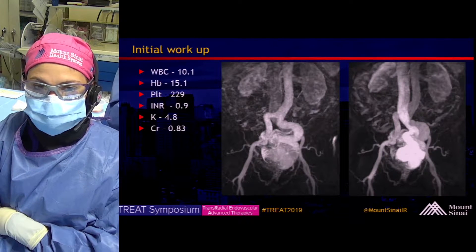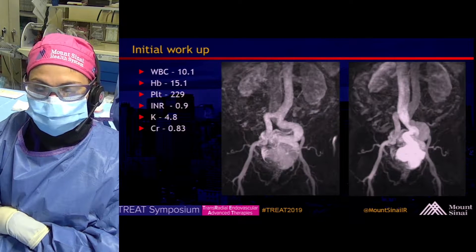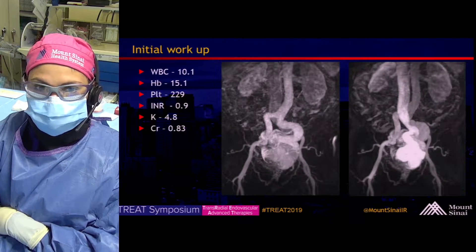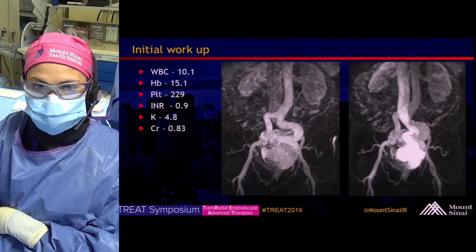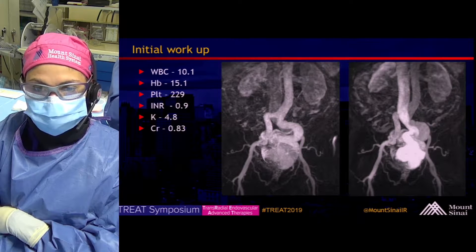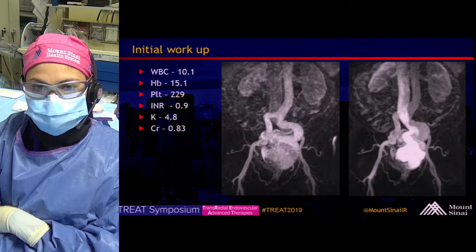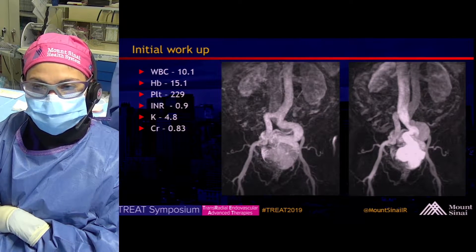This is his initial workup. You can see on the left-hand image large arterial feeders — multiple of them — and then the large draining vein on the right.